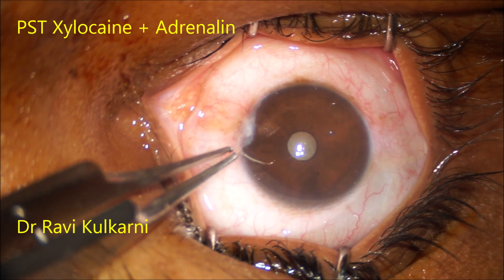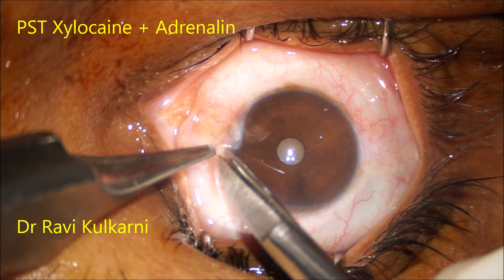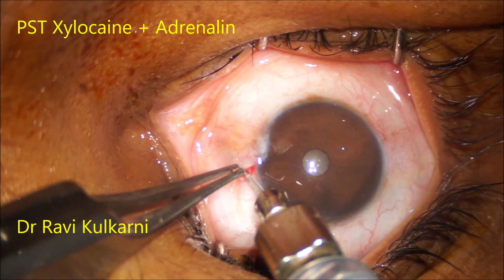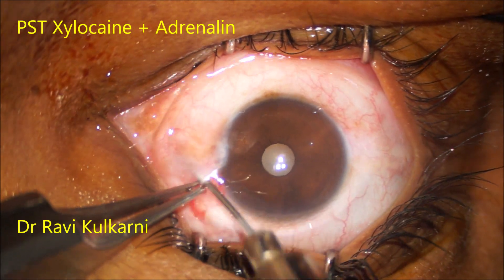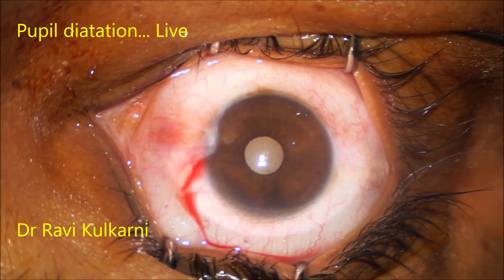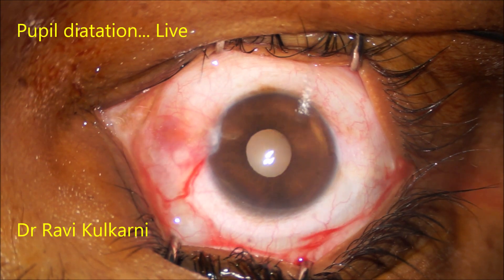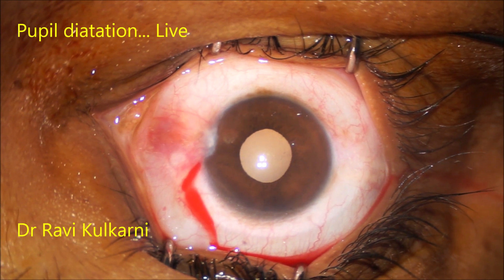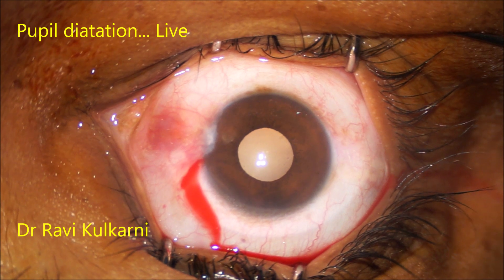Let us see one more case. This is a pterygium surgery. A small nick is given in the conjunctiva. About 1.5 to 2 mL of xylocaine with adrenaline is injected in the posterior sub-Tenon's space. The pupil starts dilating — this is at normal speed. You can see the pupil dilating, and within 15 to 20 seconds, 70 to 80% of pupillary dilatation is achieved.